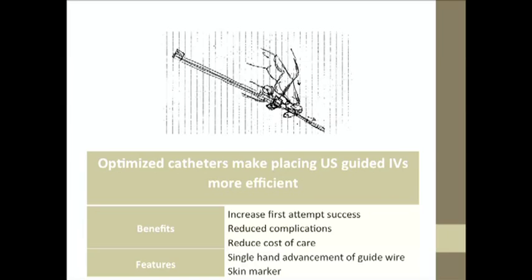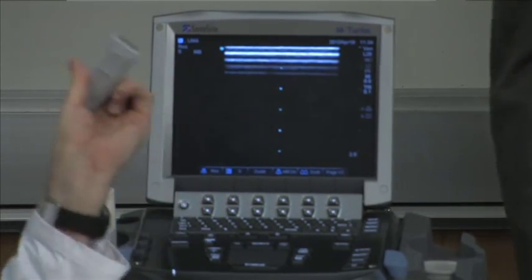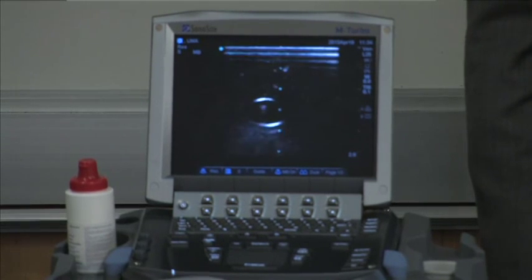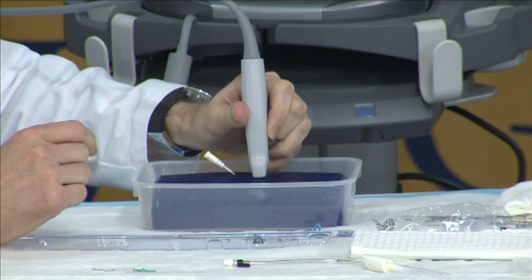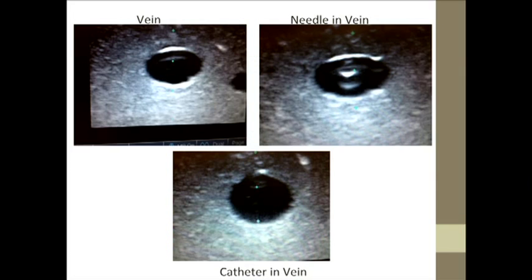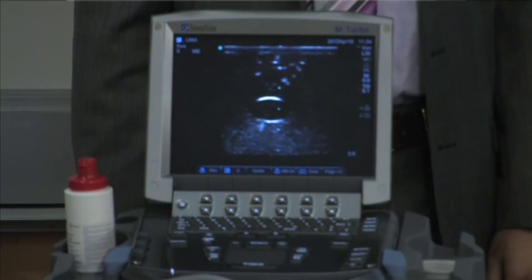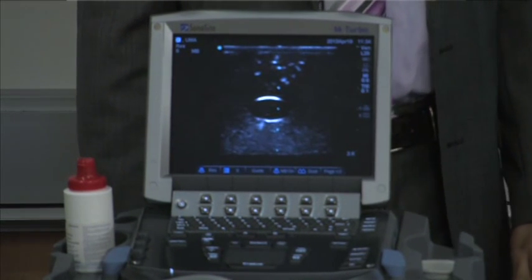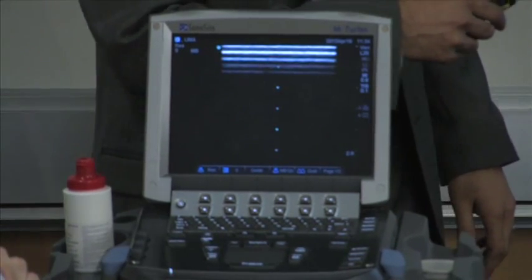So we can see we're in place, but then when we're trying to figure out where the catheter is, it's difficult to see that it's in there or not. So this image is actually of the catheter in place, but it looks exactly like this image. So once the catheter's in place, you can't see where the catheter is. So we could be in an artery or a vein. It's difficult to tell, especially in sick patients. That's very hard to tell. The blood in arteries looks the same as in veins. In very sick patients, sometimes it can be different. So, you can see the blood coming out.